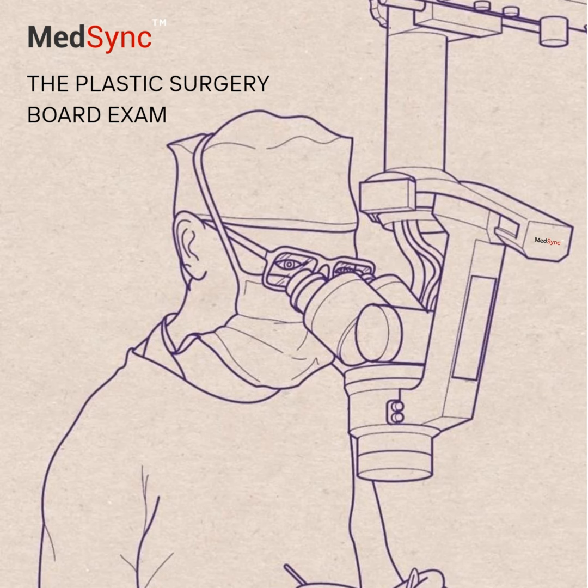What about the physical setup? Eye protection. Absolutely crucial. Laser-specific eye protection must be worn by everyone in the room, including the patient. The patient's eyes should be fully protected, often with opaque metal shields, isolating the entire orbit. Windows, airway, fire risk. Windows need opaque coverings. For CO2 lasers especially, use wet drapes around the treatment area and protect adjacent structures with metal guards. If general anesthesia is used, a laser-safe endotracheal tube is needed, and inspired oxygen concentration, FiO2, should be kept low, typically below 30%, to minimize fire risk.